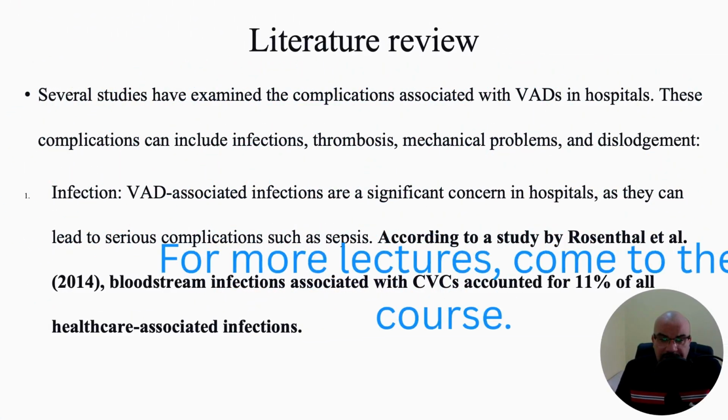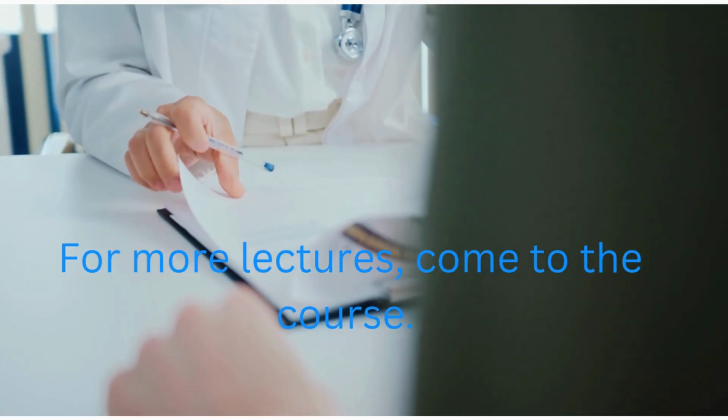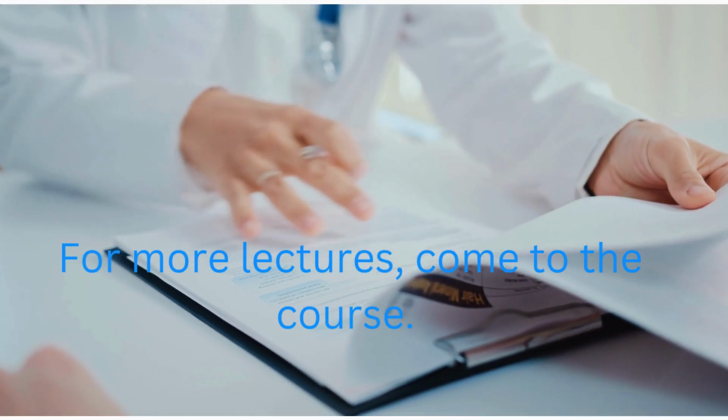Based on the literature, several studies examine the complications of VADs in hospitals. These complications can include infection, thrombus, mechanical problems, and dislodgements, and the most significant is the infection itself.